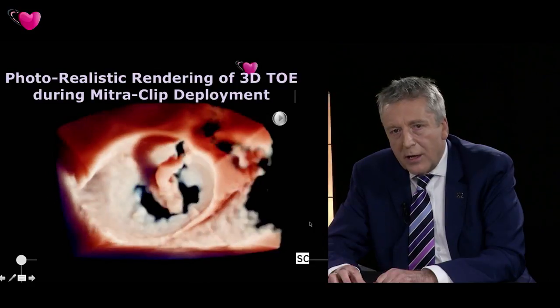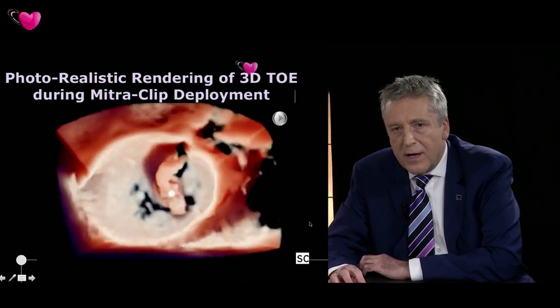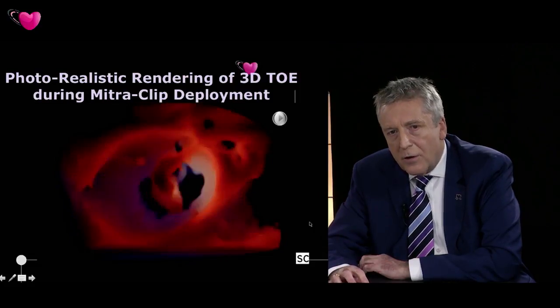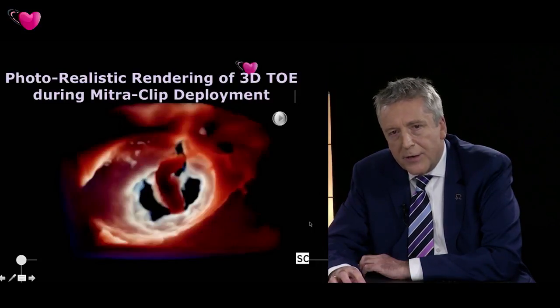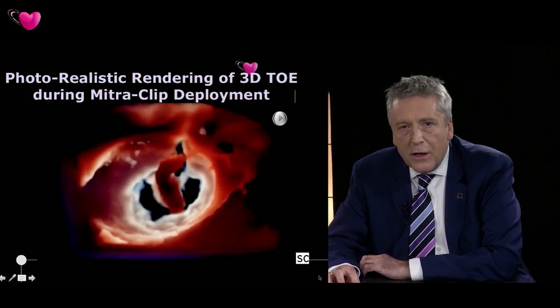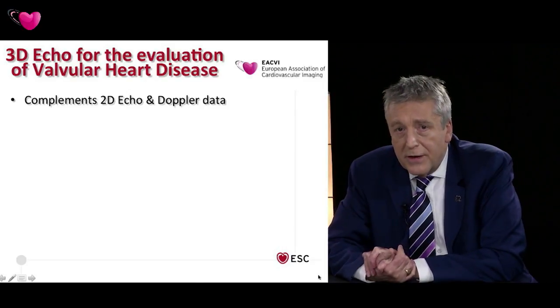And so here we are looking at it with this photorealistic imaging, and what I'm doing is changing the light source round so you can see how the shadow of the clip is cast upon the mitral valve leaflets, and now I'm taking it through into the left ventricle so that we can see the coaptation line of the mitral valve backlit from behind.